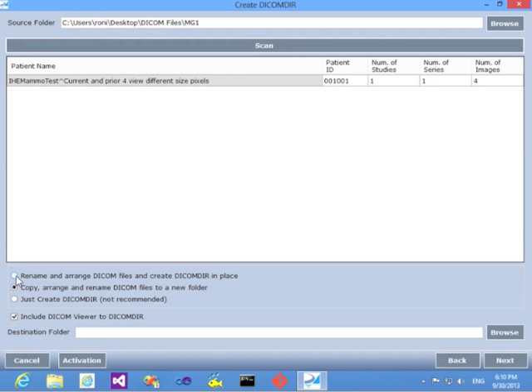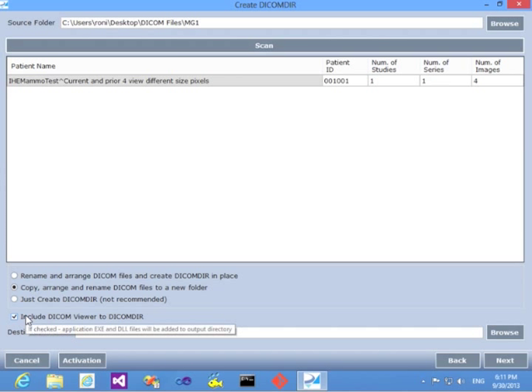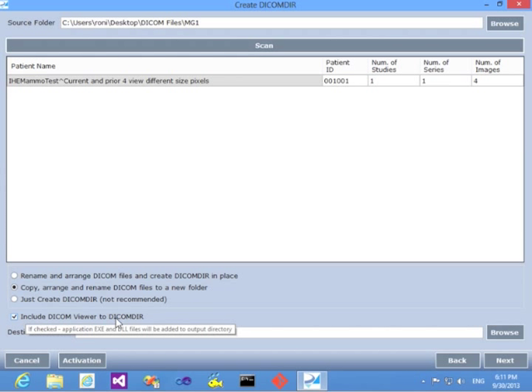I'll use the option of copying the files to a new folder with renaming the files to valid DICOM CD files. And I'll also include the DICOM Viewer, which is the Dicomizer itself, onto this folder.